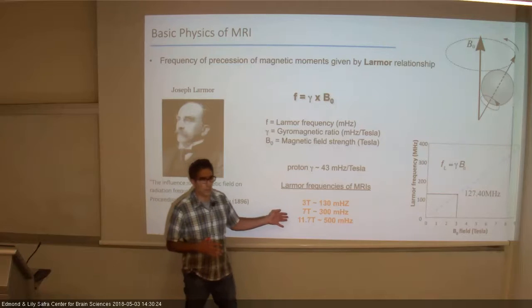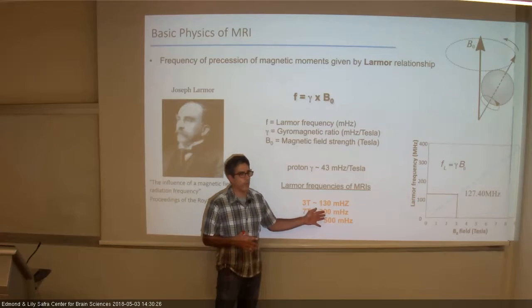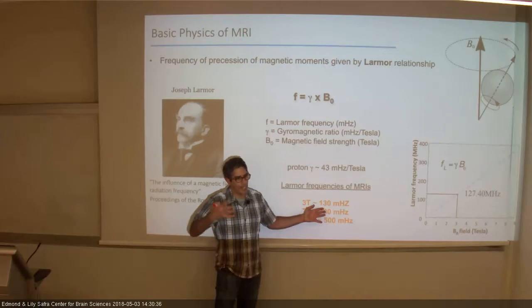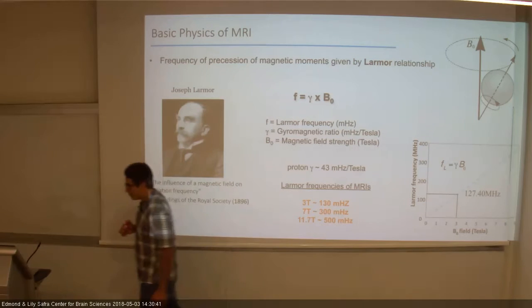We're going to play here with energies which are in radio frequency, so that's what makes it non-invasive, not causing any harm. As a tissue, we can inject a lot of this energy before we're actually heating anything, and it's fine.